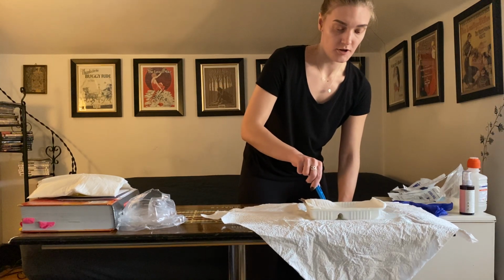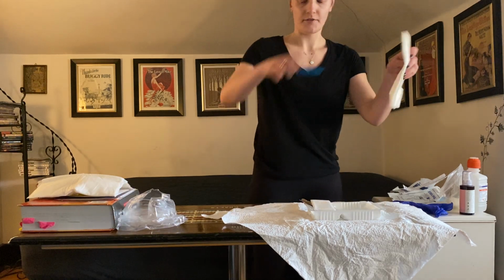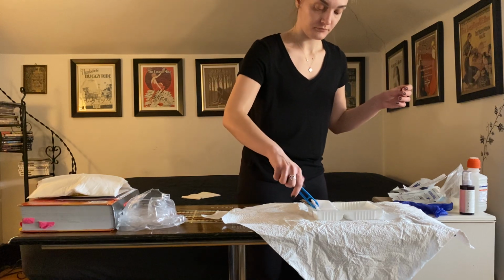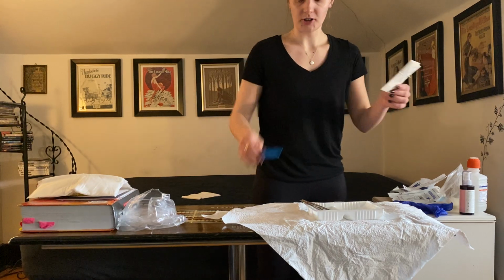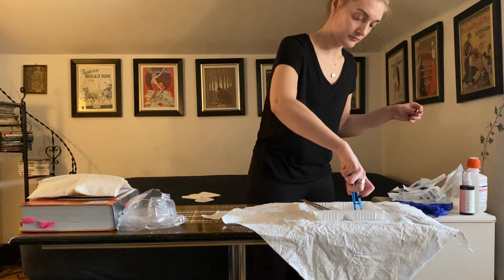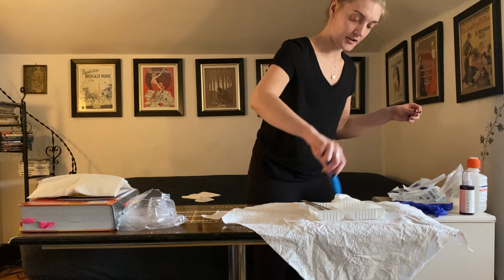Just being mindful of my 1-inch borders as well. I'm going to be taking the sterile drape out. I'm not going to be using it for this video, but I'm just going to put it to the side for right now. Garbage. I'm also not going to be using this garbage just because I have the 2 already. I just like taking these out.